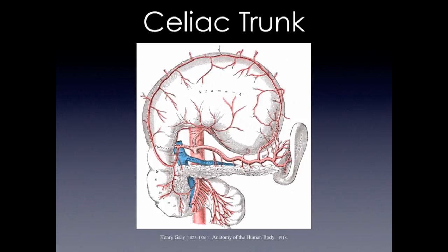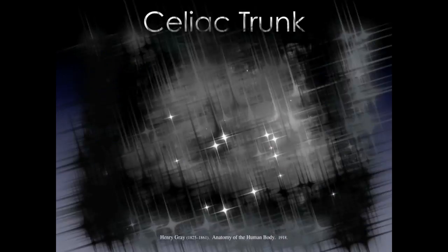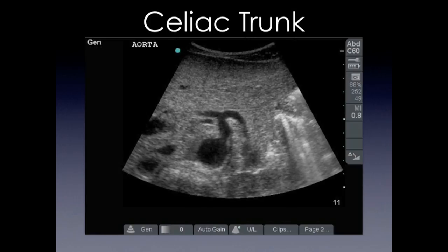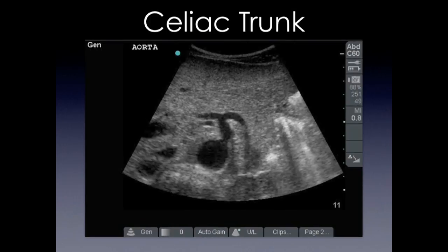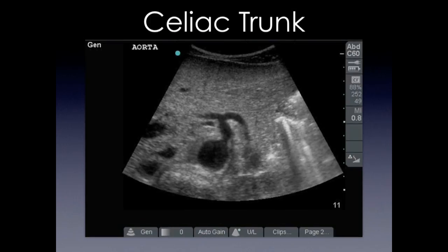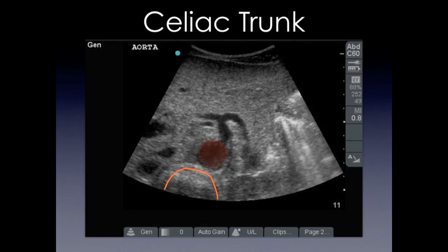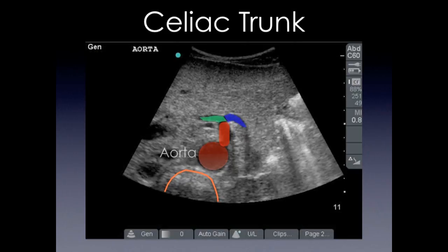Here we have a drawing from Gray's Anatomy of the celiac trunk with the stomach retracted upwards, showing the left gastric artery along with the common hepatic and the splenic artery. This is our ultrasound image where you see the spine in the inferior portion of your screen along with the aorta, the celiac trunk, the splenic, and the common hepatic artery.